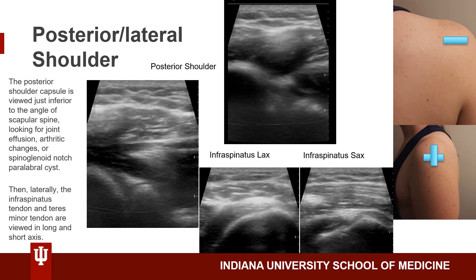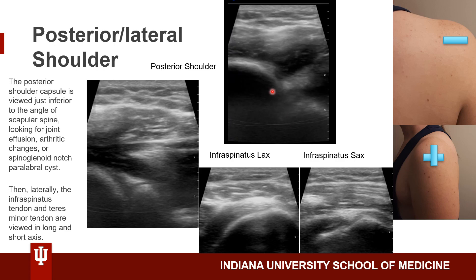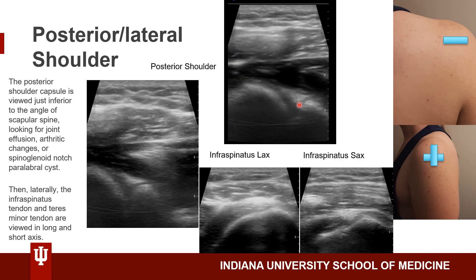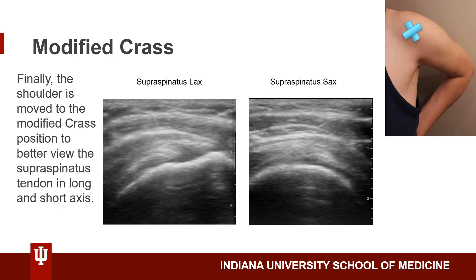We can also look at the shoulder posteriorly. This shows the humerus, the posterior joint, and the glenoid. This little triangle is the labrum of the shoulder. The infraspinatus muscle goes up over the top of the shoulder posteriorly, with the deltoid on top of that. This very small dark area is the glenohumeral joint. We can watch dynamically as the humerus rotates — you can see it rotating in the back of the shoulder. This shows the triangle of the labrum on top of the glenoid, the lateral shoulder, and the infraspinatus in long axis and short axis, as well as the modified crass position with the supraspinatus.